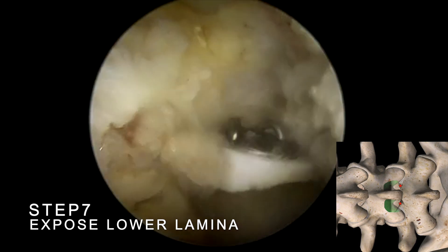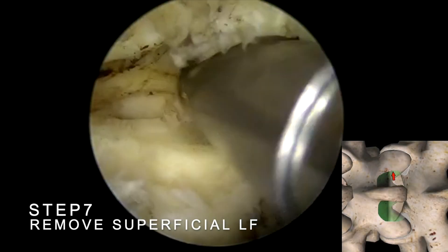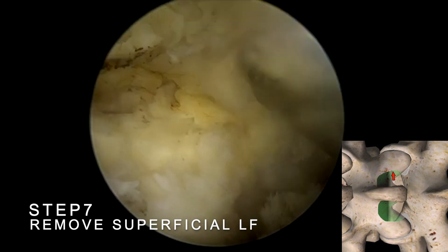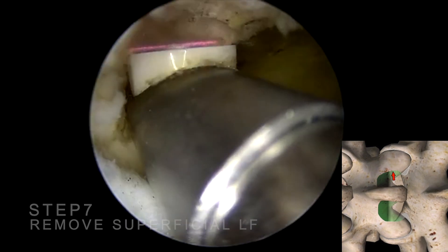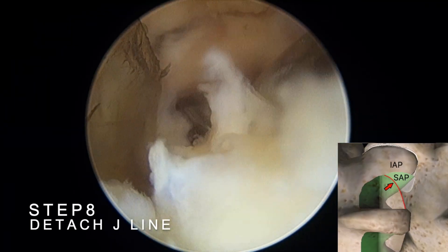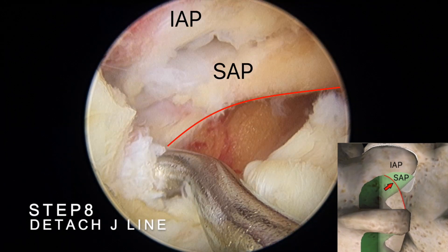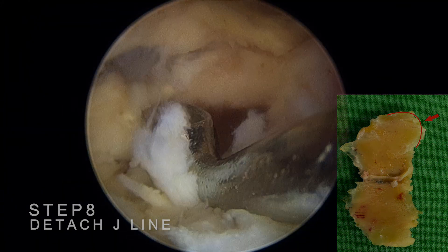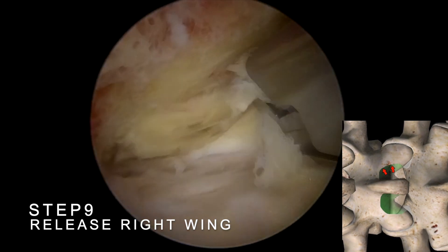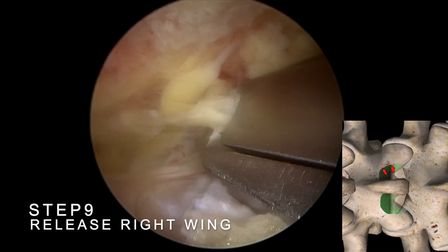Use the radiofrequency probe to expose the upper edge of the lower-level lamina. Next, remove the superficial ligamentum flavum attached above the upper edge of the lamina. Dissect the ligamentum flavum along the junction of the lower lamina and the superior articular process — known as the J-line — where the ligament is thinnest and easiest to separate. This will free the lower right portion of the ligamentum flavum. Then return to the central gap of the ligamentum flavum at the cranial end, and free the upper right portion of the ligament from this point.